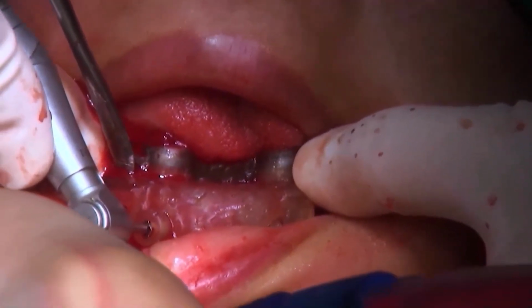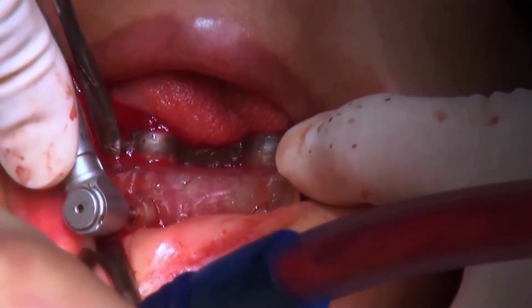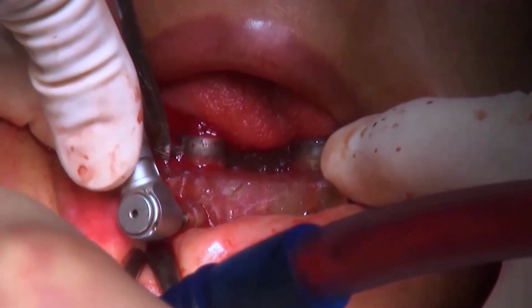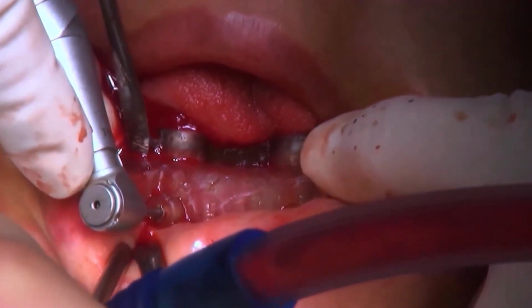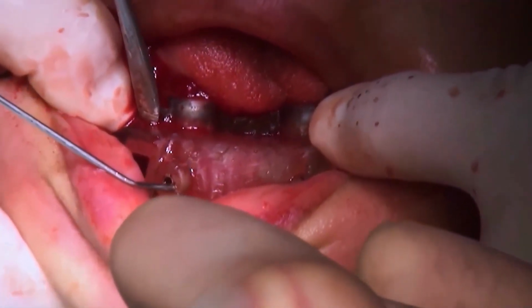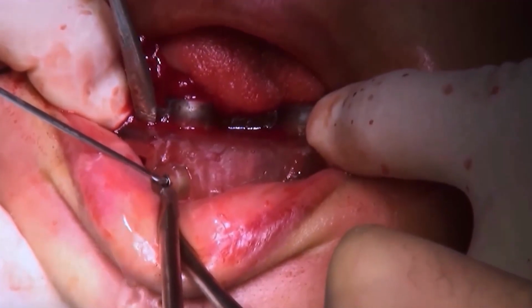Another anchor drilling for anchor screw to fix the surgical guide part. The drilling is also a low-speed drilling without irrigation. In between, saline irrigation is done into the osteotomy site.